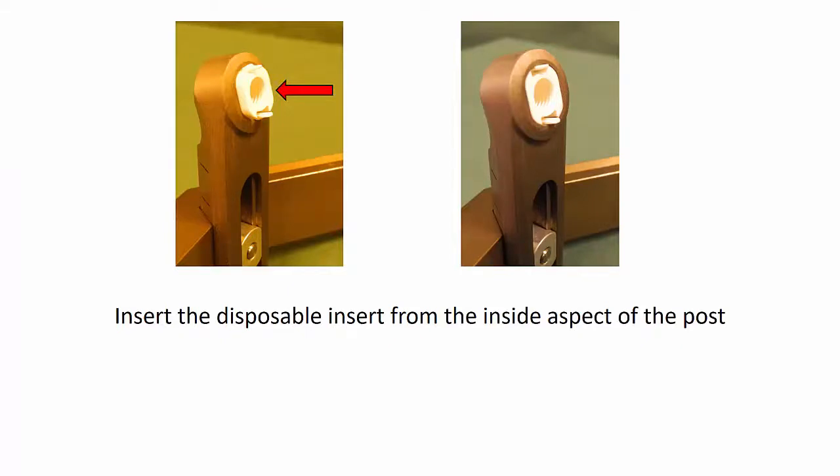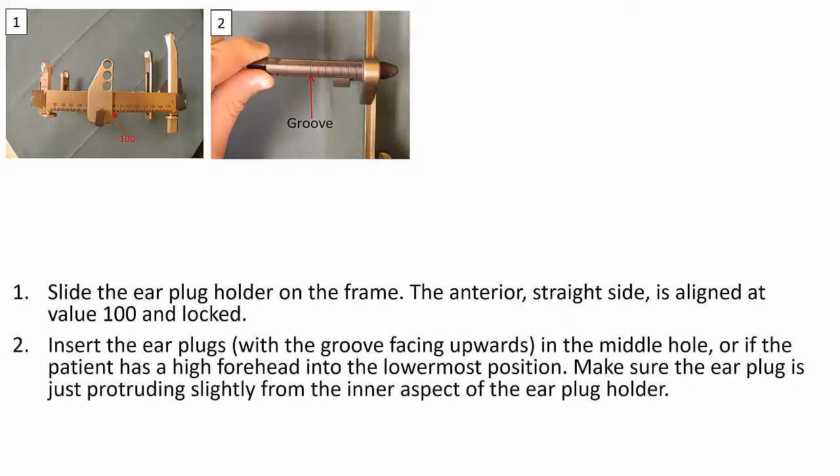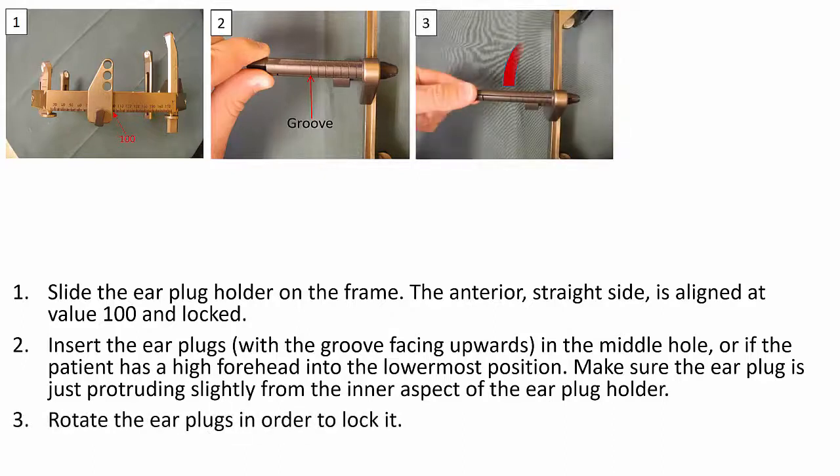We then insert the disposable insert from the inside aspect of the post. We slide the earplug holder onto the frame. The anterior straight side is aligned at value 100 and locked. We insert the earplugs in the middle hole, or if the patient has a high forehead, into the lowermost position. Make sure the earplug is just protruding slightly from the inner aspect of the earplug holder, and then rotate the earplugs in order to lock it.